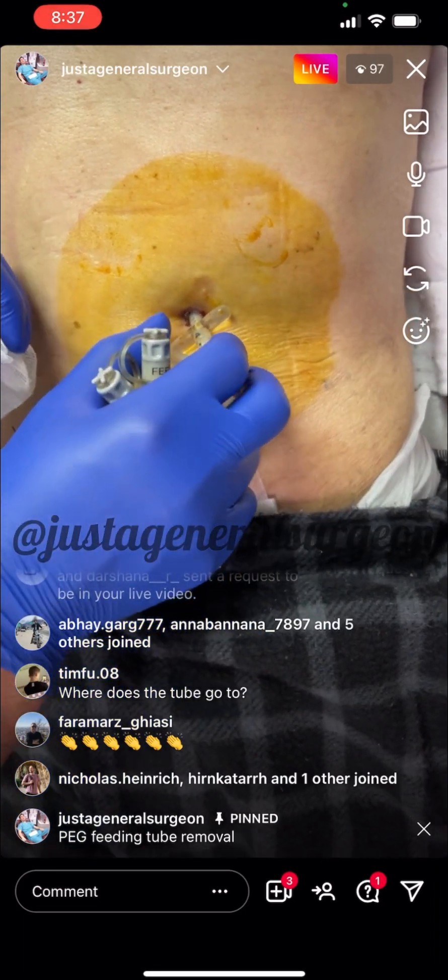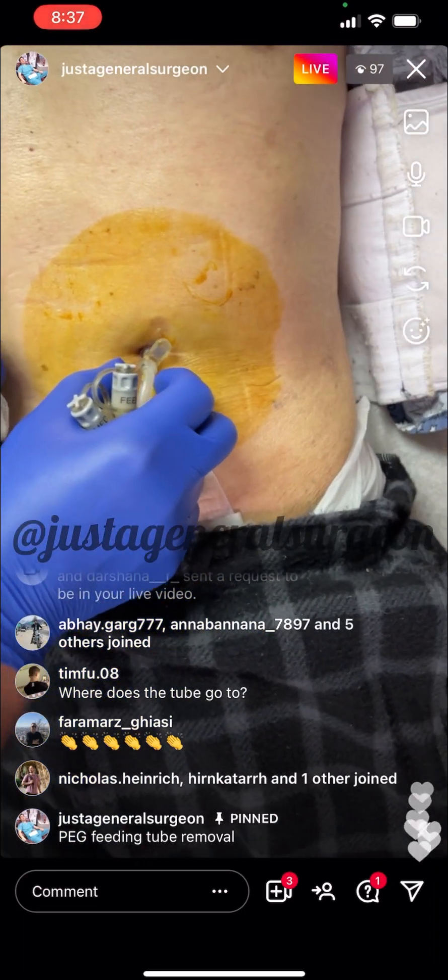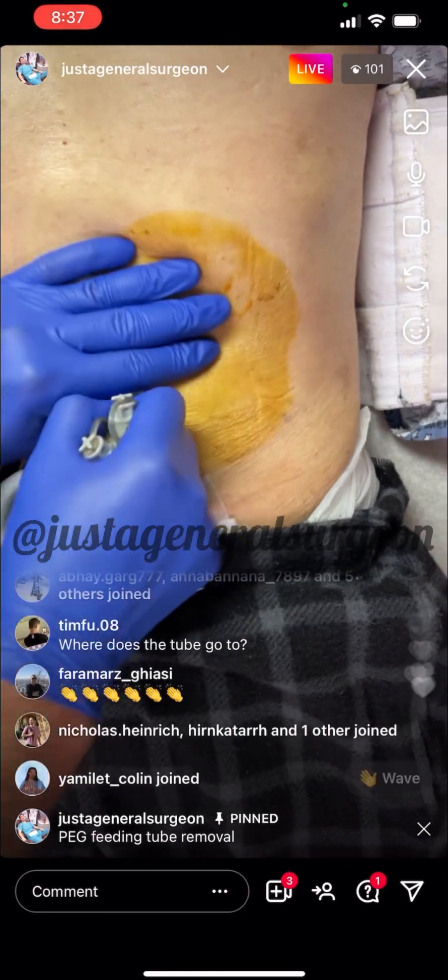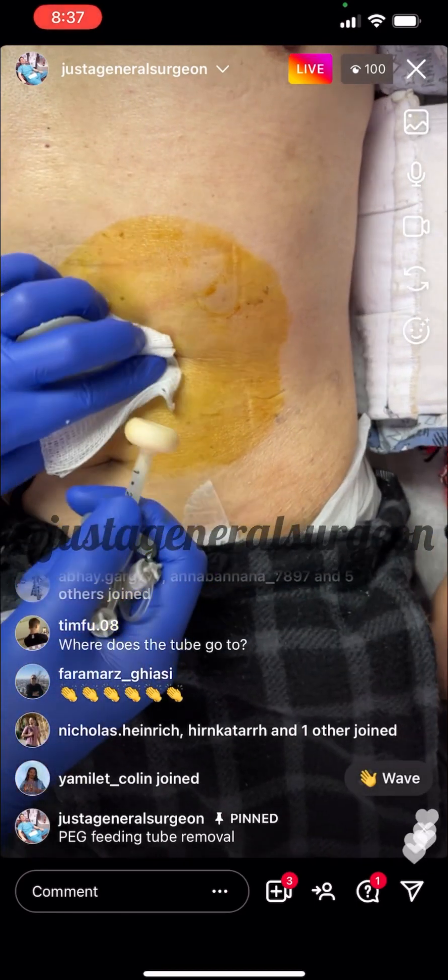We're just going to apply some firm pressure and it's going to pop right out, and I'll show you the bumper. So, one, two, three. That's it.